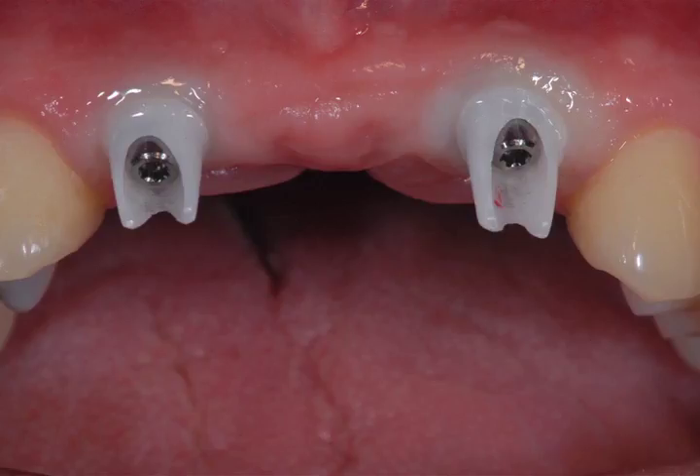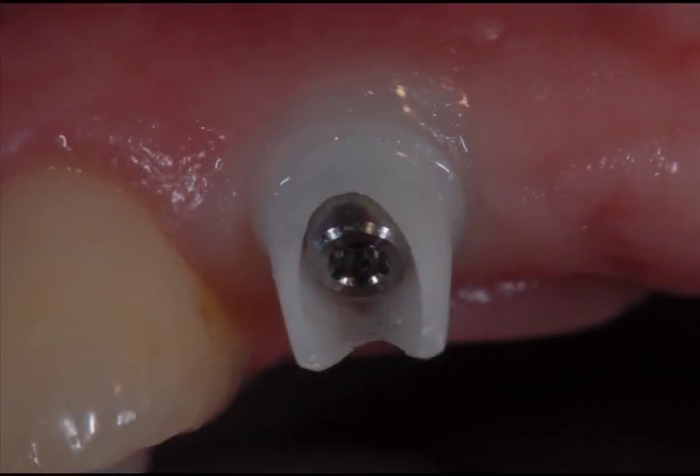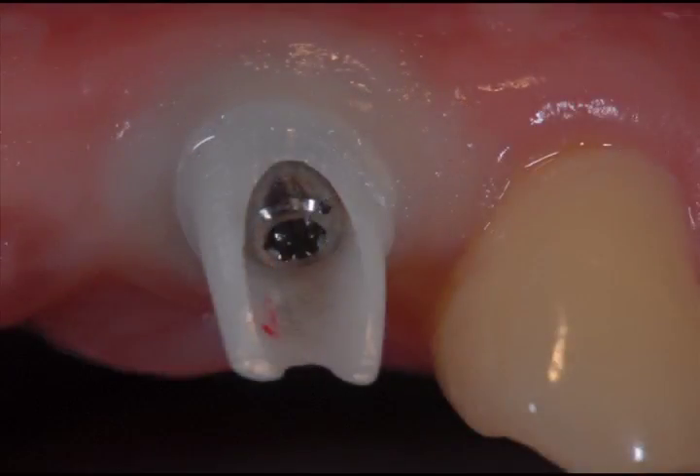The screw that holds the zirconium abutment in place — the question was whether it would clear this labial reduction. Since the screw is not in the virtual representation, it took the reality of trying it in the mouth to discover whether or not it cleared. Remember, this case was done model-less: we went from scannable abutment information to Cadent information to Glidewell design, and now we have the actual abutments and the final four-unit bridge to place on top of the abutments. We put this together and there was a slight blanching around the tissue, but that's normal. Here is a close-up showing how close it was to clear the head of the retention screw in the zirconium abutment. The other side looks very nice and seated perfectly against the implant fixture.